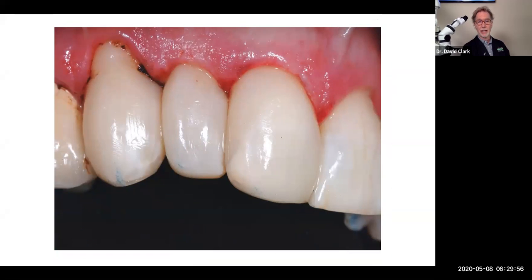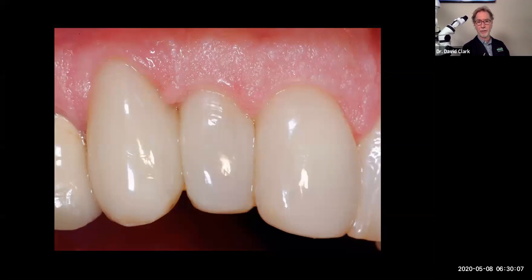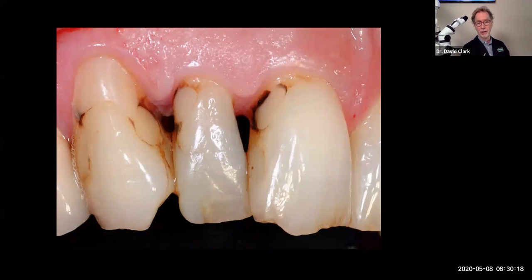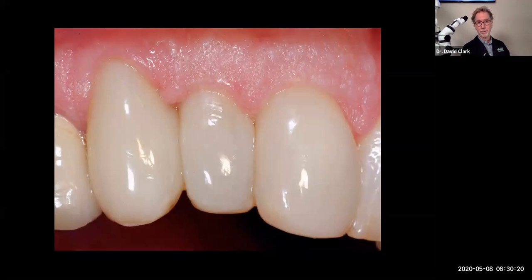We talked about this last week. We injection overmolded some anterior teeth. I hope that you and Taras asked for that. Tell us, just do live demos last week. We did a bunch of these teeth. How do you injection overmold a tooth? Quickly, efficiently. Now, you may think that the anatomy of these teeth are weird. You know what? In a patient like this, the last thing you want are black triangles full of food. So that is unsustainable. This is the Bioclear method, and it works.